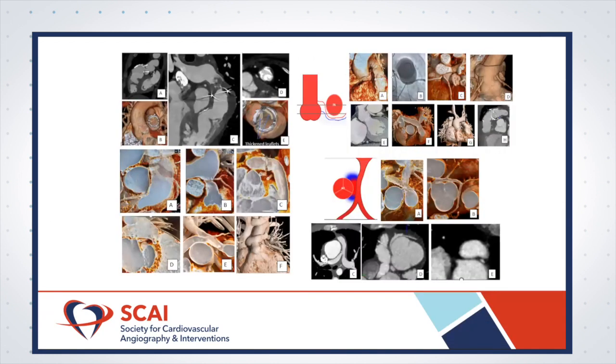These are just examples, a lot of pictures I know, but on the top left you can see an example of endocarditis. You can see valve leaflet calcification. You can see hypoattenuating leaflet thickening with restricted leaflet motion. I think the reason that's important is that some of these patients might be able to be medically treated before they get a transcatheter valve.